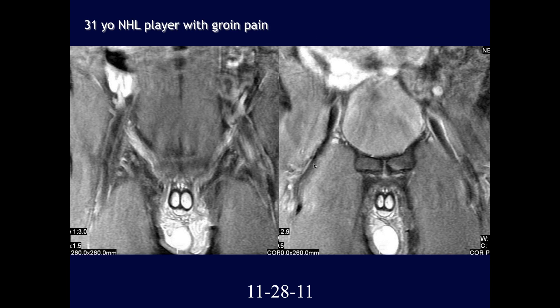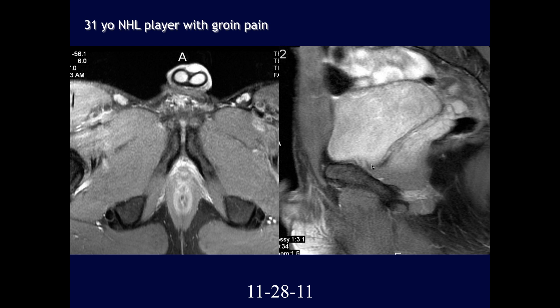A 31-year-old NHL hockey player with groin pain. Coronal images through the pubic symphysis show trace marrow edema along the left pubic symphysis and increased fluid signal at the bilateral adductor longus attachments, greater on the left — findings concerning for athletic pubalgia.